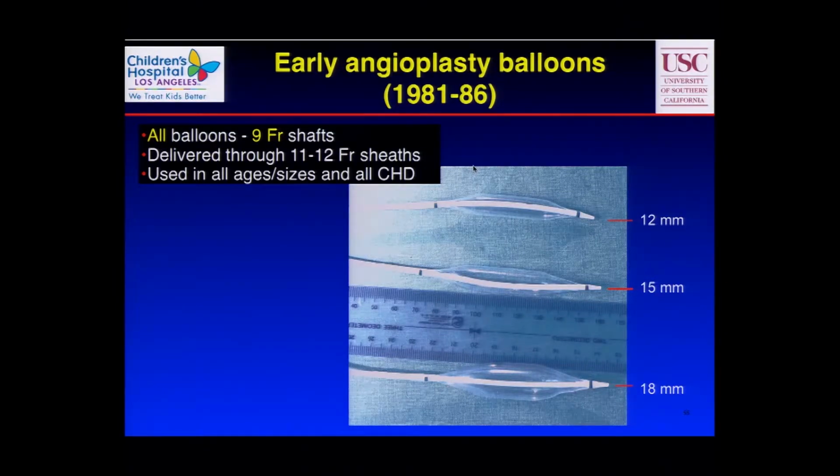We had a rule of 7. 7 years old, anybody less than that, 7 French was what we used. Of course, now we go to much smaller sizes.